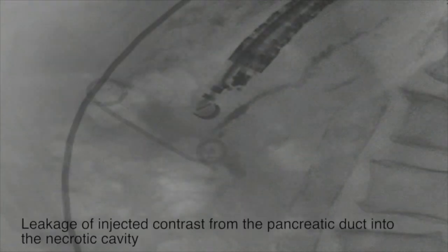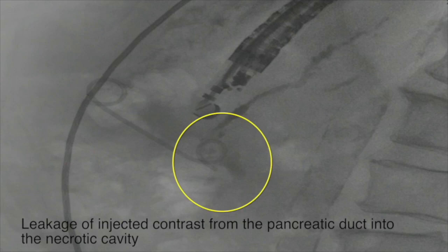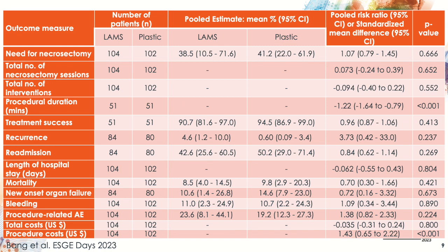On injection of the main pancreatic duct under EUS guidance within the area of the body of the pancreas, contrast was seen leaking from the main pancreatic duct and into the area of the walled-off necrosis cavity, consistent with disconnected pancreatic duct syndrome. In a recent meta-analysis of randomized trials, we found no difference in clinical outcomes between LAMS and plastic stents for drainage of necrotic collections.